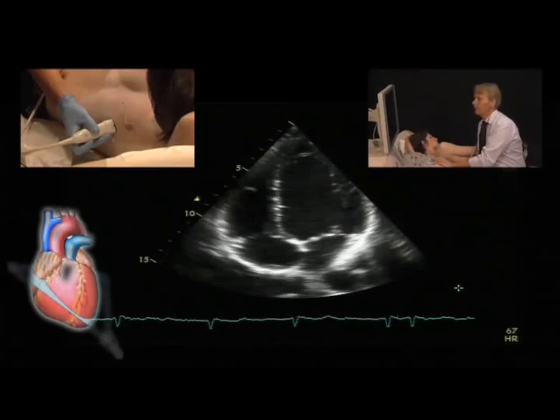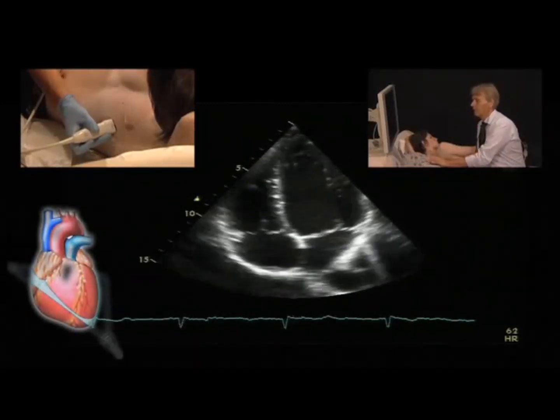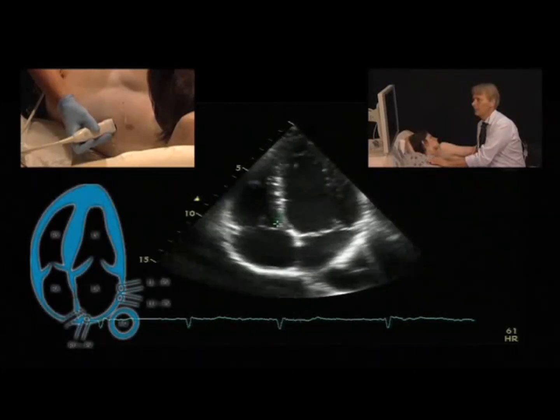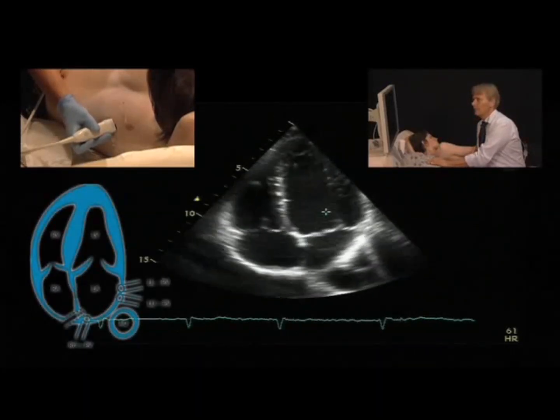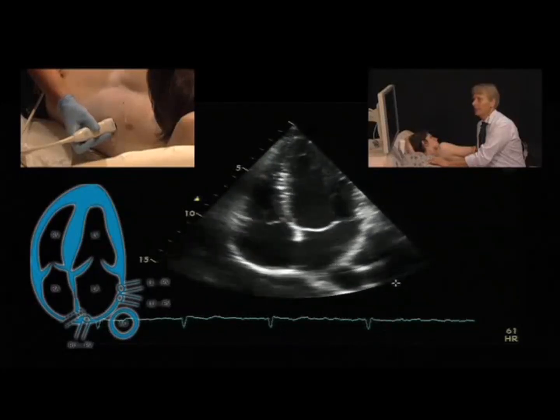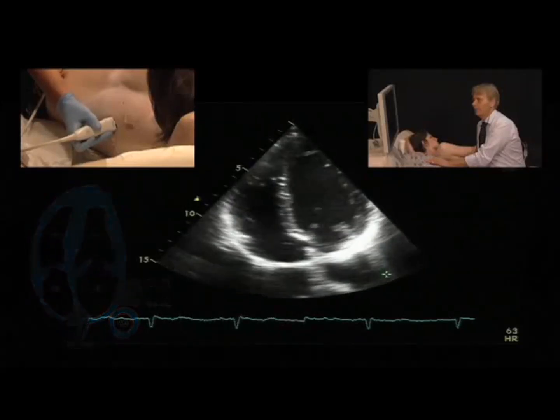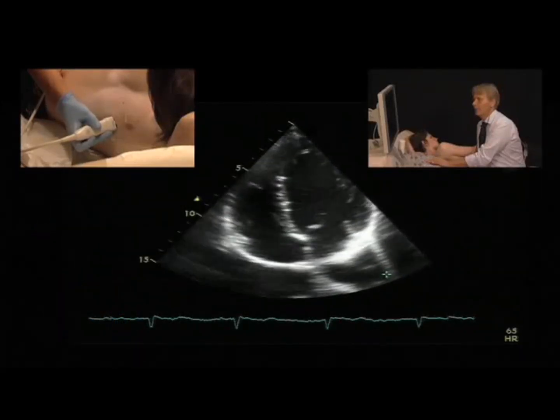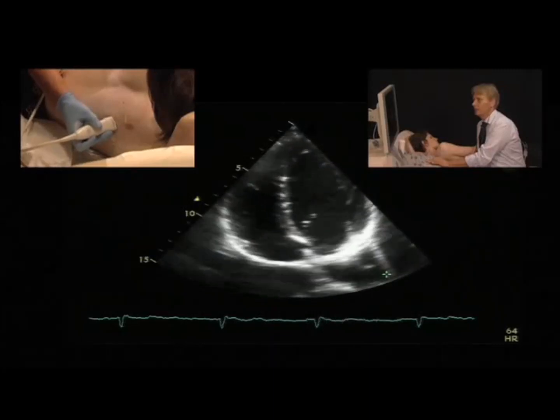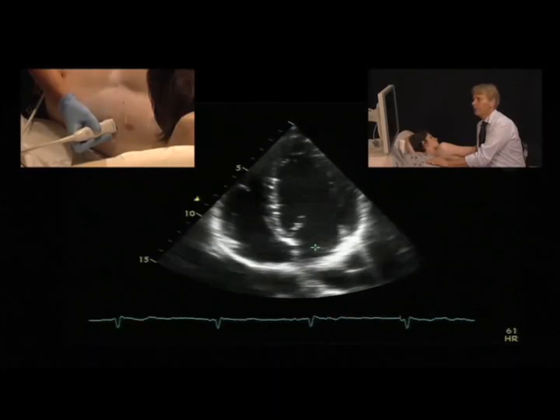The four-chamber view should be oriented so that the septum is parallel to the ultrasonic beam. It is also important to check that the atria are as large as possible, because a suboptimal angle means you don't have an optimal four-chamber view. You have to tilt until you really get large atria.